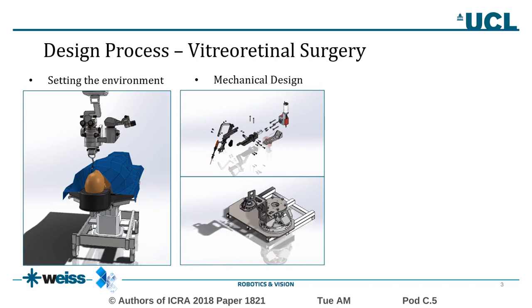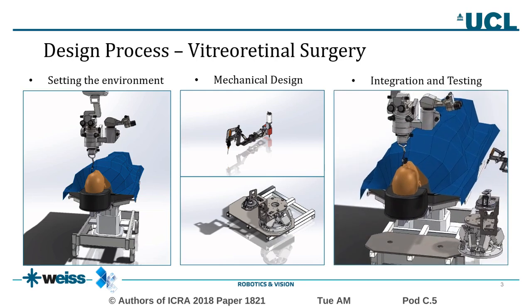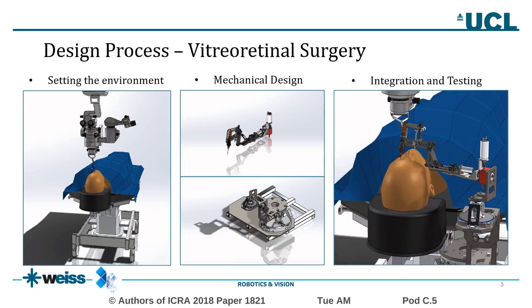Subsequently, we proceed with the design of the robotic manipulator, based on what retinal surgery requires in terms of motion, taking into consideration the spatial conditions that exist in the operation room, and of course by following the presented process to motorize the parts of the system for which we believe that custom solutions might be more appropriate for the needs of this application. The final step includes integration of the designed robotic tool into the surgical environment and testing in order to ensure that the robot's function is within the range of the constraints imposed by the environment itself.